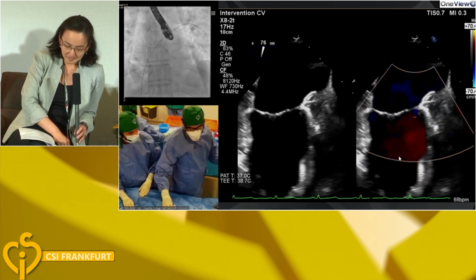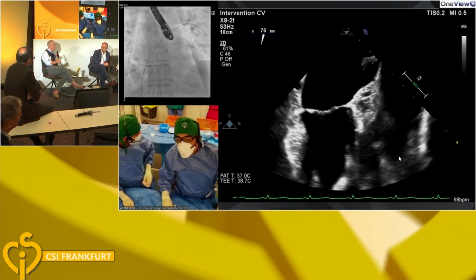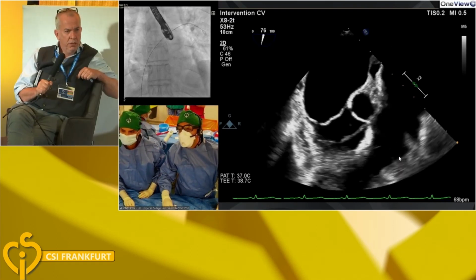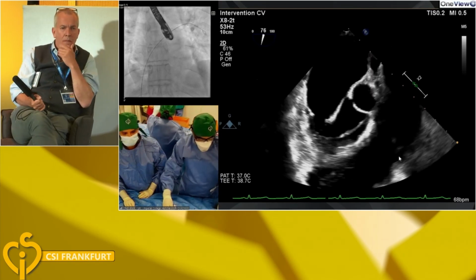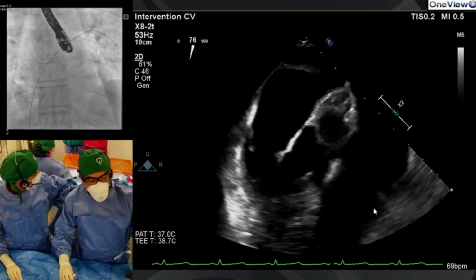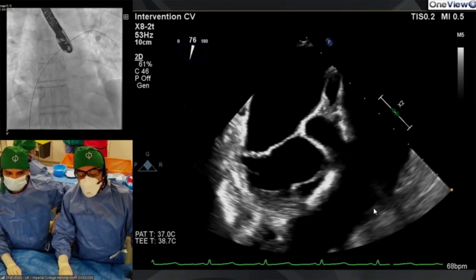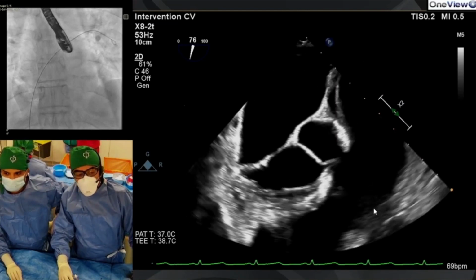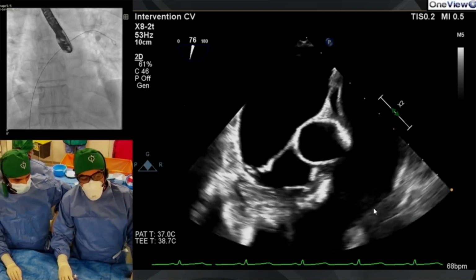Okay, so 25. So the options are a 25-18 or a 25-25. You don't need the bigger size on the left atrial side, though, do you? No. So the standard device is a 25-18 for a cocoon. I'm told in the lab that that device isn't available. So the options are for cocoon a 25-25, or we switch to an alternate vendor. I think we should maybe try the 25-25, see what that looks like. If it doesn't look good, we can take that out and then switch. I think that would be probably the most appropriate.